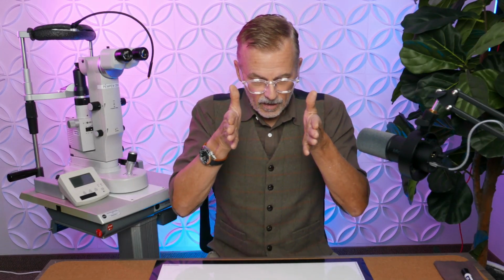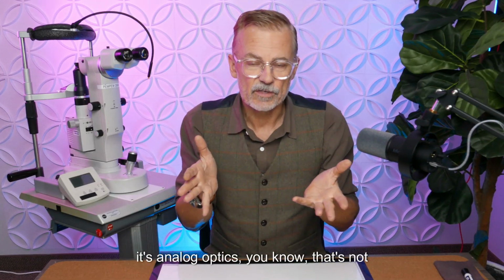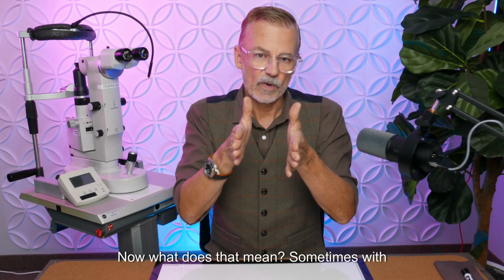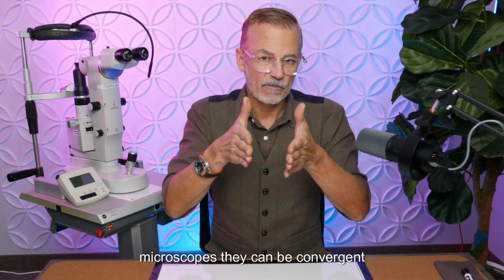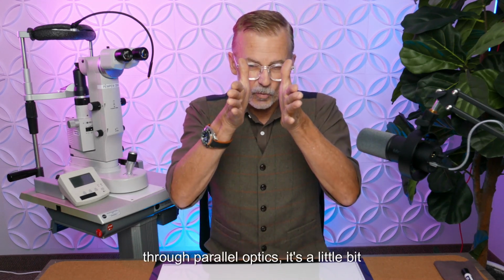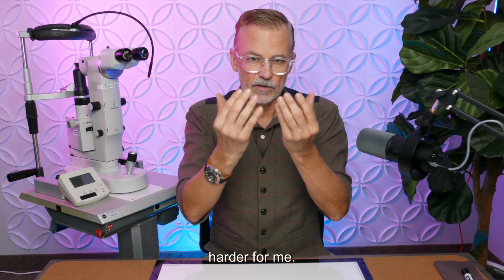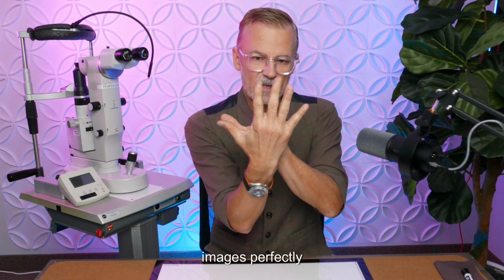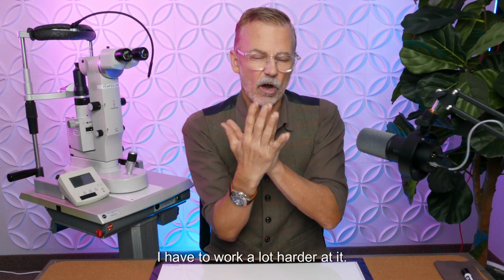As far as the optics, it's analog optics. It's not digital or anything like that. And they appear to me to be fairly parallel optics. Now, what does that mean? Sometimes with microscopes, they can be convergent and they can be parallel. I personally have a little bit of a latent esophoria. So when I'm looking through parallel optics, it's a little bit harder for me. It's a little bit more work and a little bit more uncomfortable for me to get those images perfectly lined up. I have to work a lot harder at it.